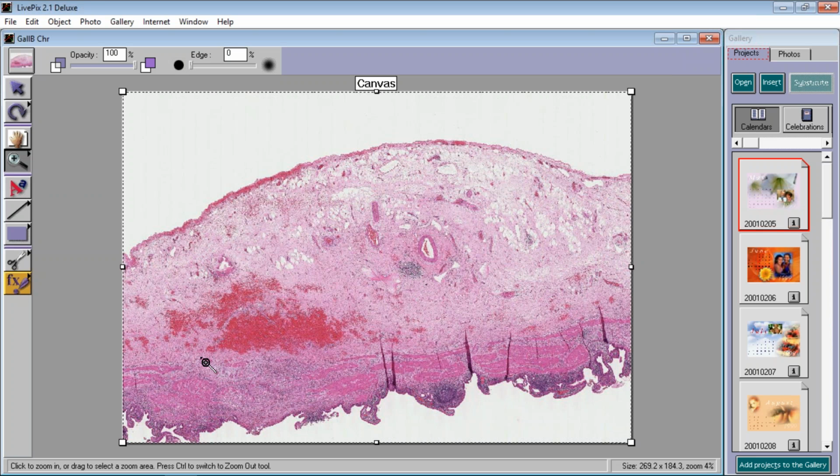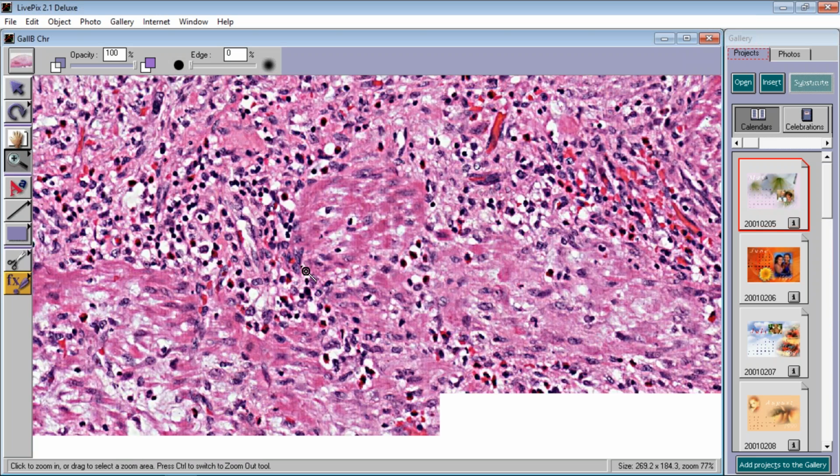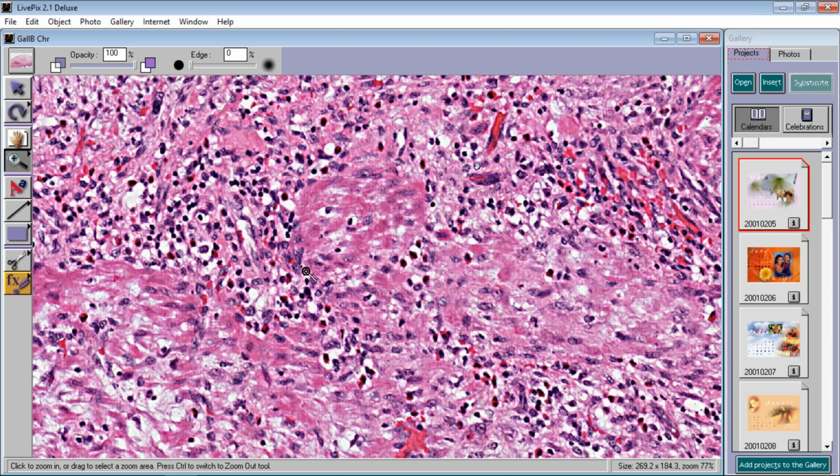But what I'm going to ask you is, these inflammatory cells that you see within the gallbladder wall and the gallbladder muscle, this is strictly an opinion poll. This is not a medical question for a yes or no answer. Are most of those inflammatory cells lymphocytes or neutrophils? That's the question. Just be honest, because if some of you say neutrophils, guess what? You'll be right. But if some of you say lymphocytes, you'll also be right.